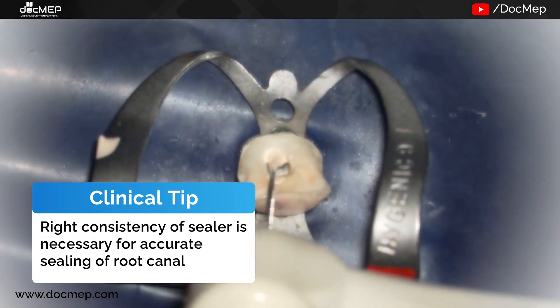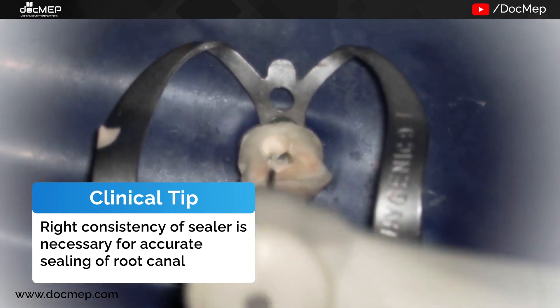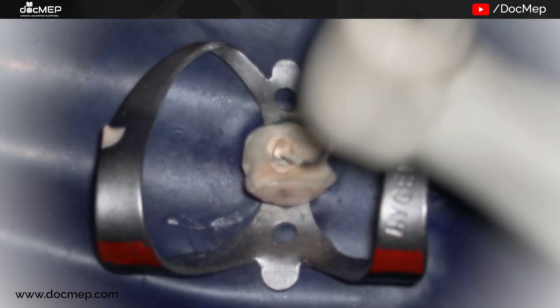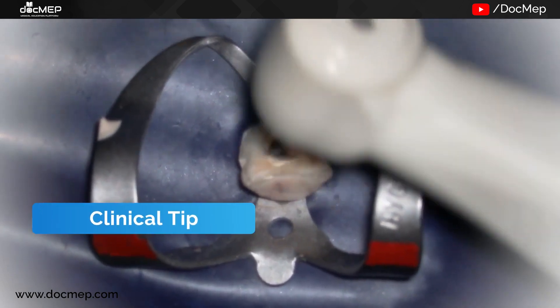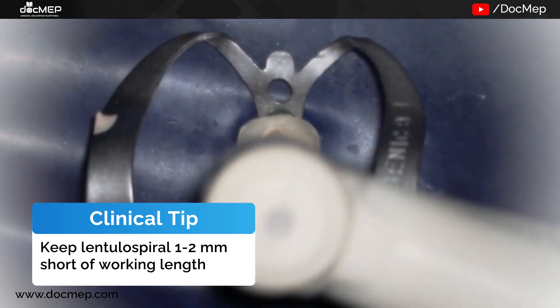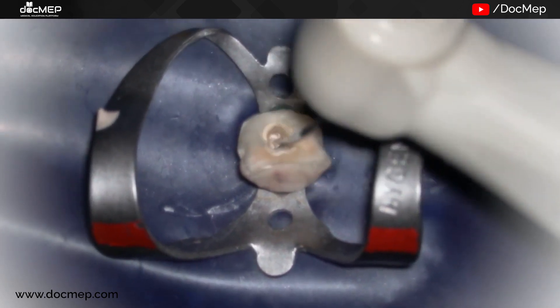At low speed, the lentulo is rotated keeping it 1 to 2 mm short of the working length so that the sealer doesn't extrude outside. The movement is circumferential as well as up and down so that all the sealer gets spread evenly in the canal.